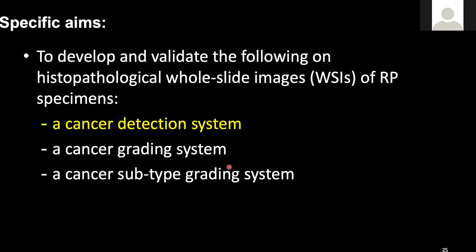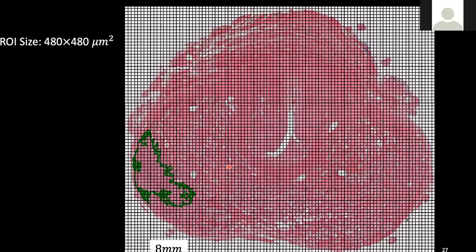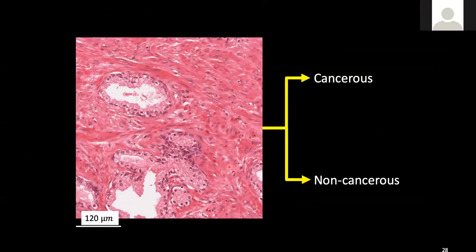For the first specific aim for cancer detection, here shows the material we use. We use 299 whole mount tissue sections from 71 patients, including 1.3 million 480 by 480 regions of interest. All images were mainly annotated by our GU pathologist. Our method involves partitioning the whole mount slide image into a set of regions of interest, shown as a grid, with a size of 480 by 480 microns. We want the system to differentiate each region of interest as cancer versus non-cancer, so we can map out the entire whole slide image to show the cancerous region.